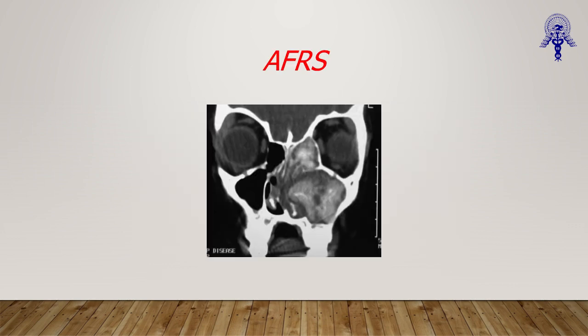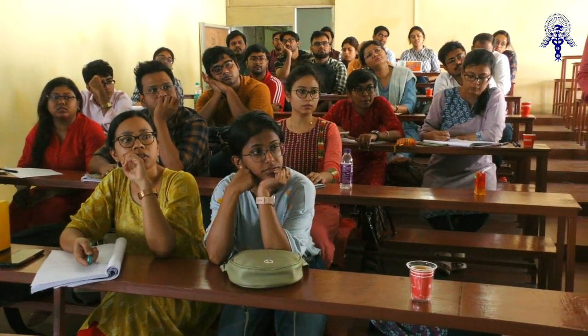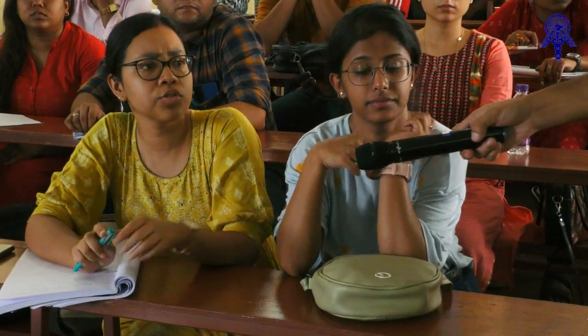AFRS, anybody can tell me, our 5 minute nebo? Anybody can tell me the diagnostic criteria of AFRS? Radiological criteria. Bony expansion, hyperdensity. Serum eosinophilia and positive fungal smear. Okay, so she has told us everything.